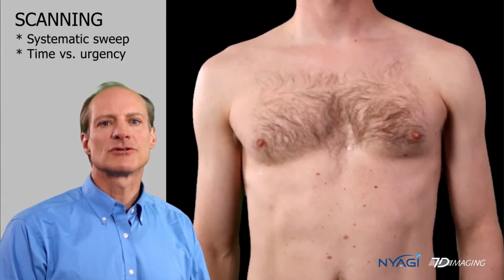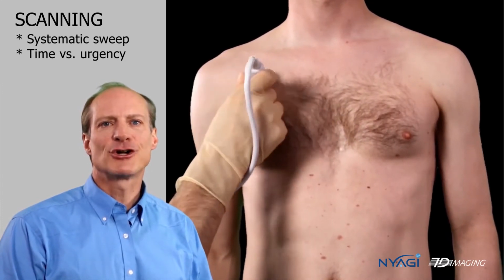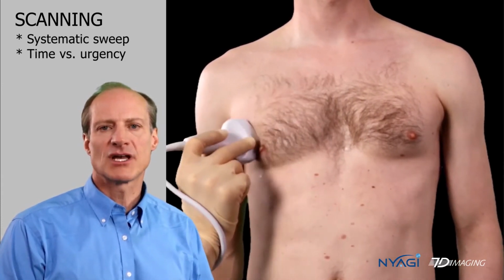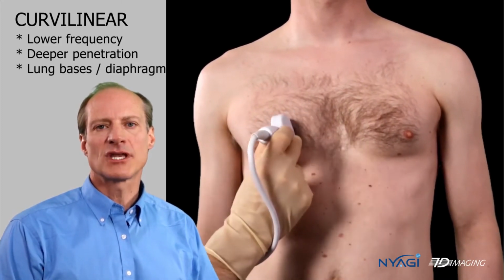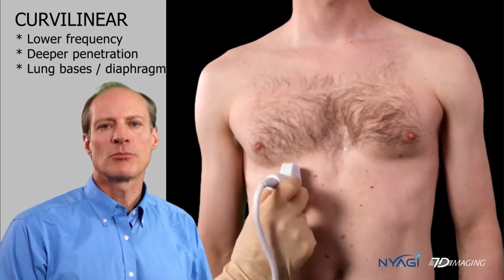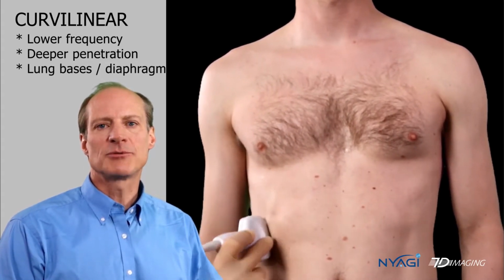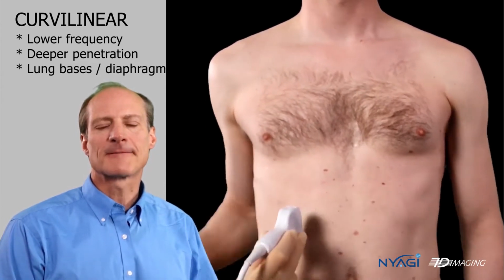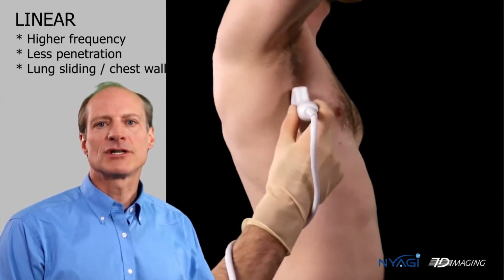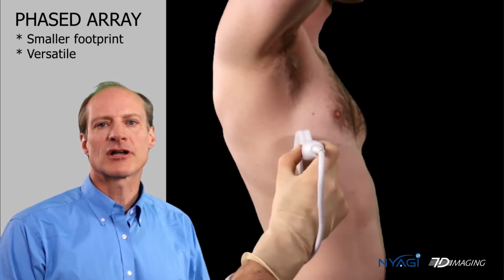How do you do lung ultrasound? You want to approach it in a systematic way. Time and urgency will determine what type of study you do. I find that a low-frequency curved probe is best for doing a lung scan because you can look at the deep structures of the lung along with the superficial pleural sliding. It's important to scan all lung fields, anterior, lateral, and posterior when possible.